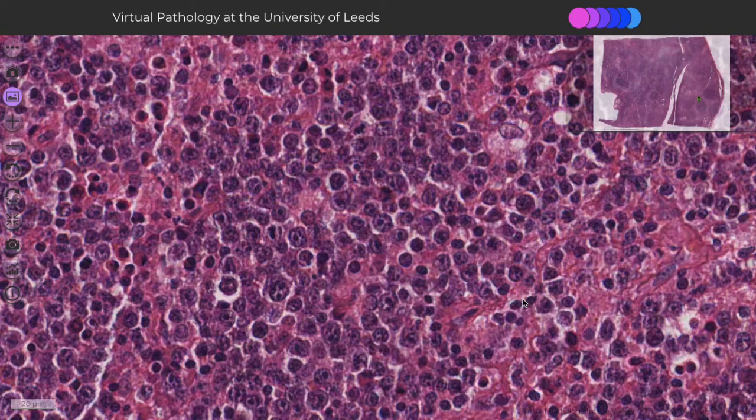Testicular lymphoma may be primary to the testis, or it could be secondary involvement by a systemic lymphoma. More often than not, or at least in most cases, this will be a diffuse large B-cell lymphoma, such as in this case. But immunohistochemistry will be prudent in terms of subtyping the lymphoma. It is more common in elderly males, maybe above 60 years onwards, as compared to your more common germ cell tumors, which are often seen in younger adults in the 3rd and the 4th decades of life.